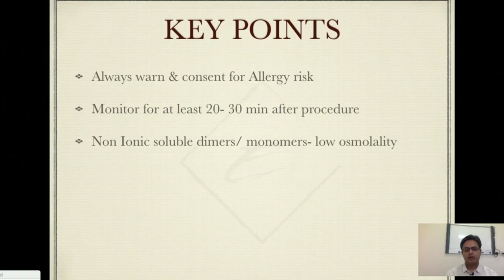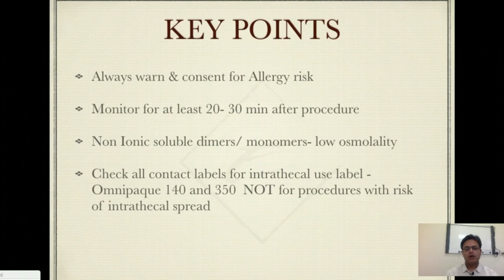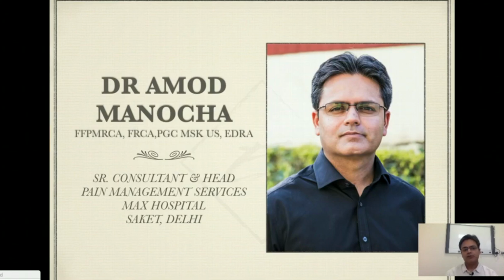Now, if you are using the contrast agent, it's best to use a non-ionic one with low osmolality. And then even in these, like if you're using Omnipaque, you should be aware that Omnipaque 140 and 350 are not licensed for intrathecal use, so please use alternative ones. And then if you have no other choice in terms of the contrast, and somebody's got a severe allergy and you already have to use a contrast, then probably worth considering gadolinium-based contrast agent. Now, that brings us to the end of the presentation.